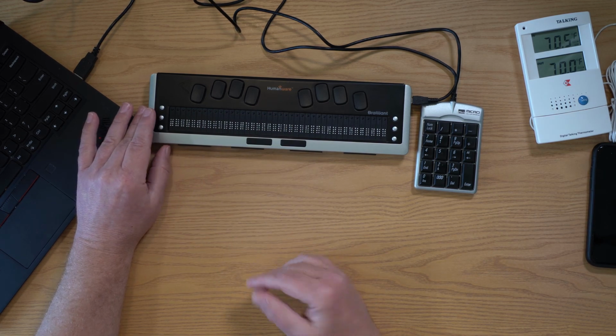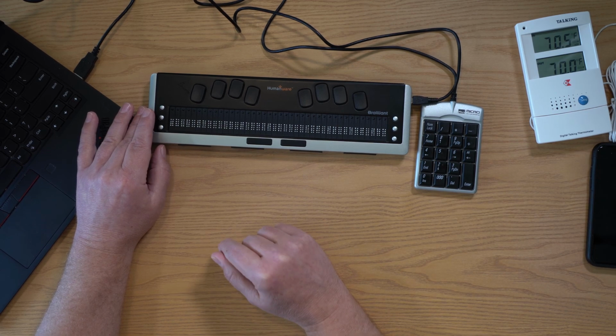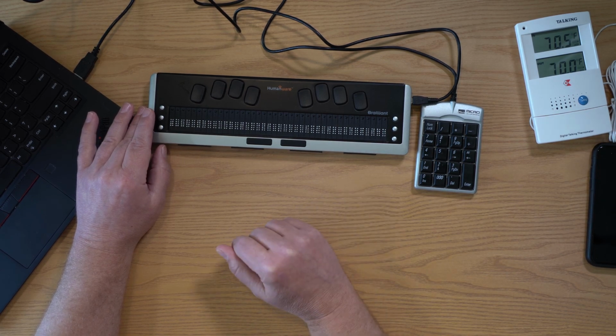So very powerful. And again, think of a person who's deaf-blind. This is the way they access technology these days, either a smartphone or a PC. And again, they can use it to navigate a PC or even communicate. You could send me a text, and I could send you a text just using this device. All right, so that's some of the high tech.